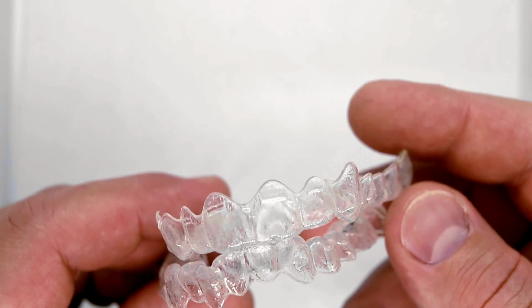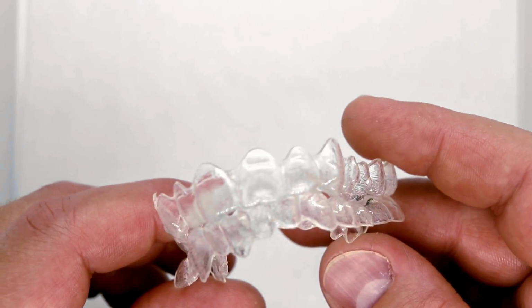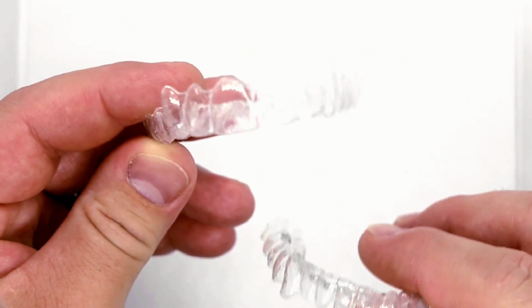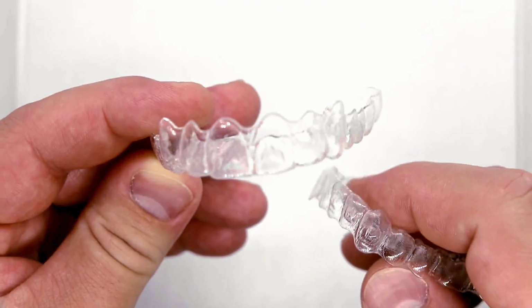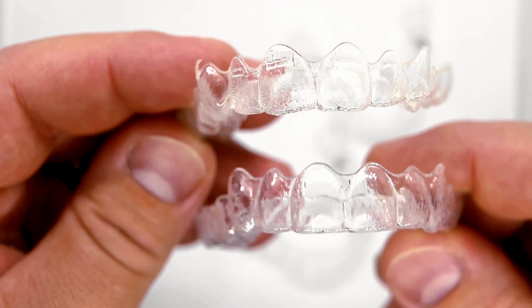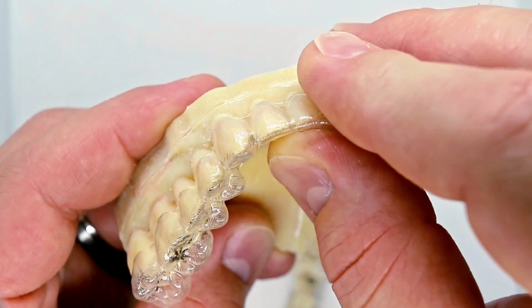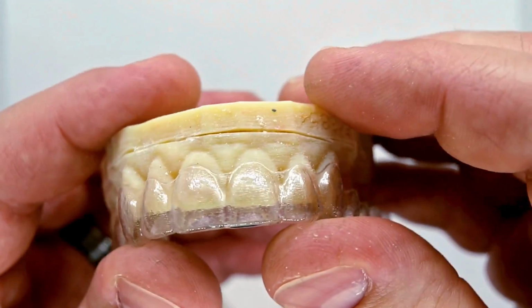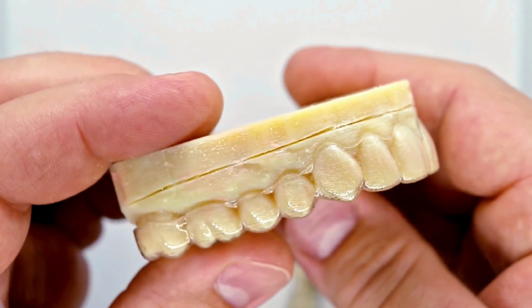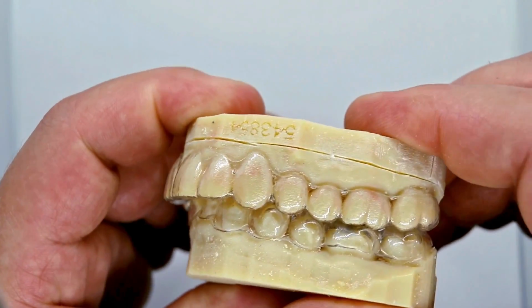They are a metal braces alternative made from a strong specialty plastic that are molded to your teeth to fit comfortably in your mouth. As you make progress, you will switch out of aligners into new ones that make slight adjustments each time until you get your final aligner with your desired result. Soon I'll have a video showing how I put my aligners in and how I take them out, as well as some tips to help you make the most of your aligners and possibly speed up your process.